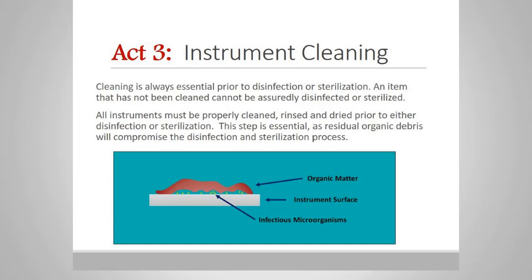We do not know if the sterilant can penetrate the debris on the instruments and kill those microorganisms or not. Thus, all instruments must be properly cleaned, rinsed, and dried prior to sterilization. The step is essential as organic debris will compromise the disinfection and sterilization process.